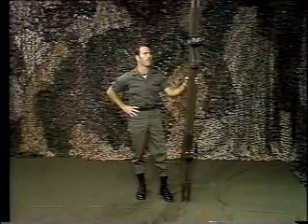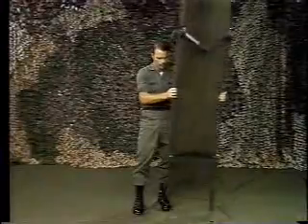The piece of equipment that we will be working with this morning during this presentation is the Army Standard Rigid Litter. This litter is found in all of our gear and facilities and, in fact, all of our field medical units. Now, before we can set the litter up, it's necessary that we undo the strap fasteners from around the litter. This will allow us to grasp the litter rails and open the litter up.